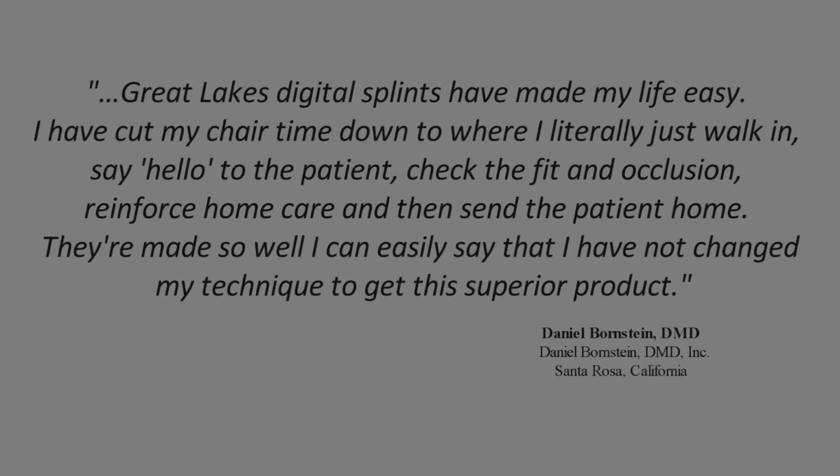Great Lakes digital splints have made my life easy. I have cut my chair time down to where I literally just walk in, say hello to the patient, check the fit and occlusion, reinforce home care, and then send the patient home. They're made so well, I can easily say that I have not changed my technique to get this superior product.